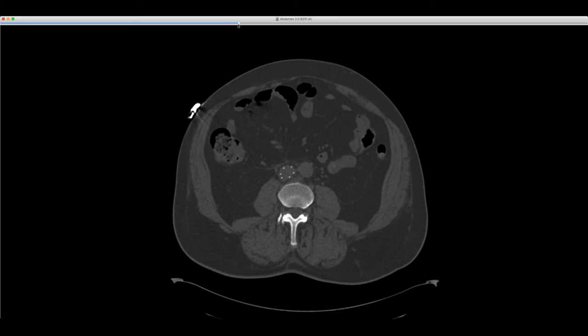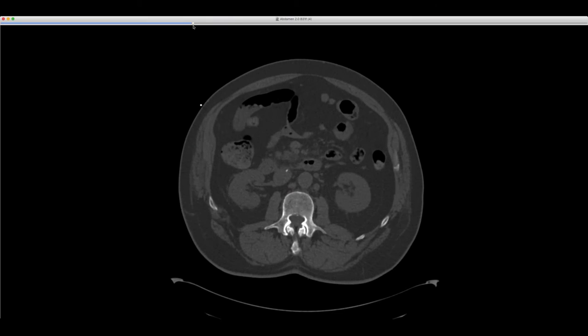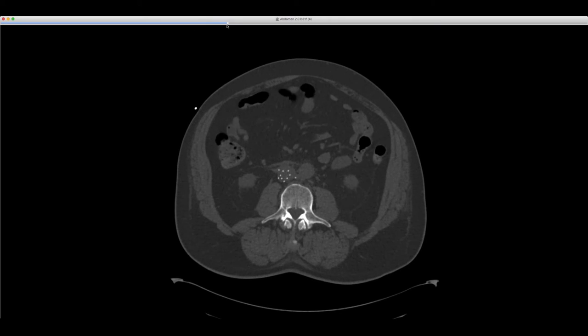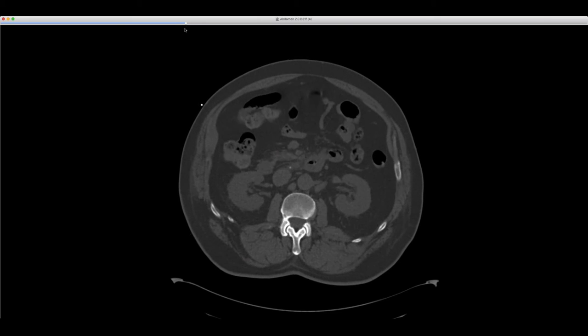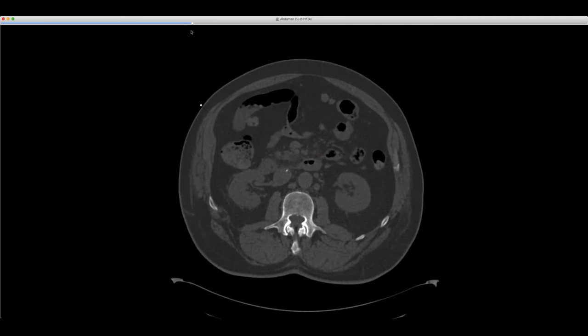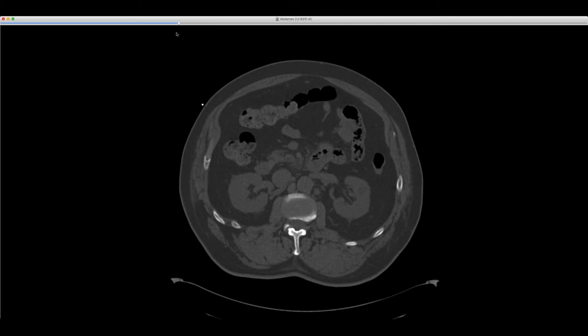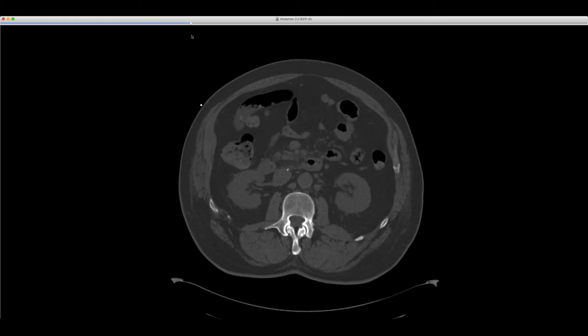And Travis, what kind of filter do you think this would be? That's got to be a Bard G2 Express. Exactly. And you can see that multiple struts are outside the IVC wall. In particular, look at this funny one that's going outside. I was wondering if it went into bowel, but it really doesn't go into bowel. It's like a little area of local inflammation in the mesentery there, presumably from that strut extending out there. So you wonder if there's a leak there, localized inflammation.